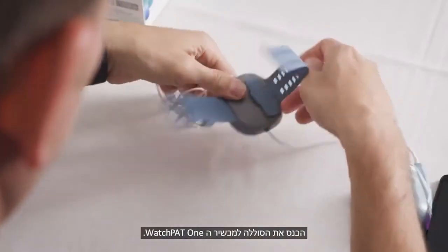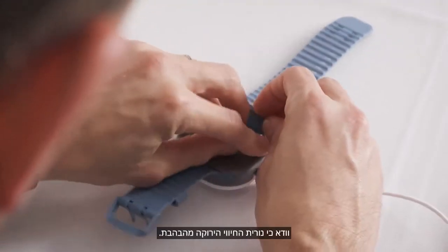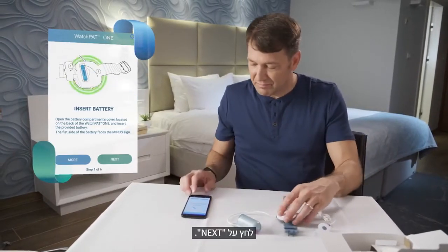Insert the battery into the WatchPat 1 device. Make sure the green indication light blinks. Press Next.